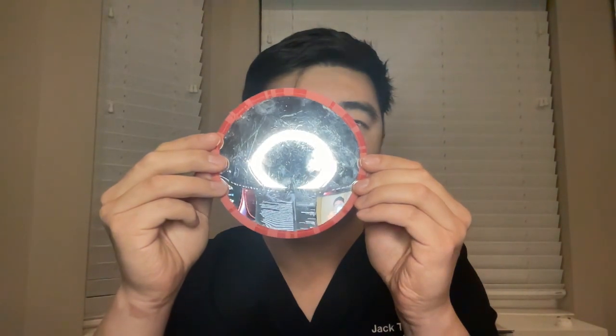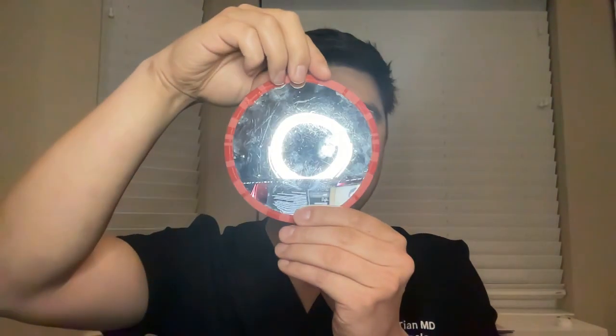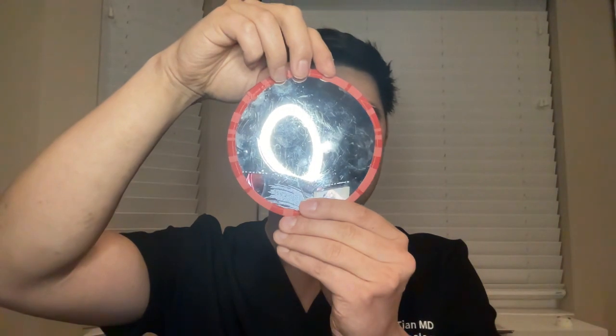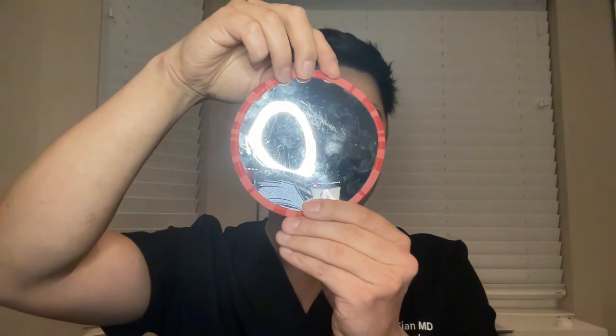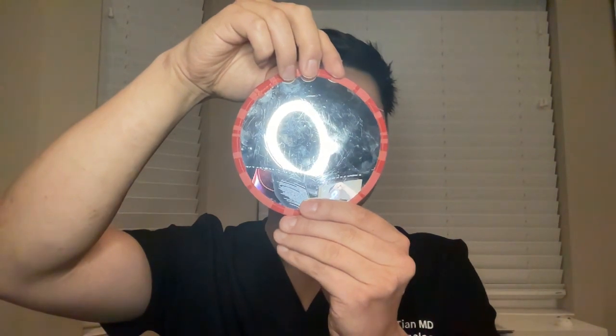I'd like for you to pay attention to this ring of light. If I put slight pressure on one axis, in this case 180-degree axis, you can see that the ring will become an oval shape. And likewise, if I were to apply the same pressure in the other direction, you obtain another oval shape stretched out from up to bottom.